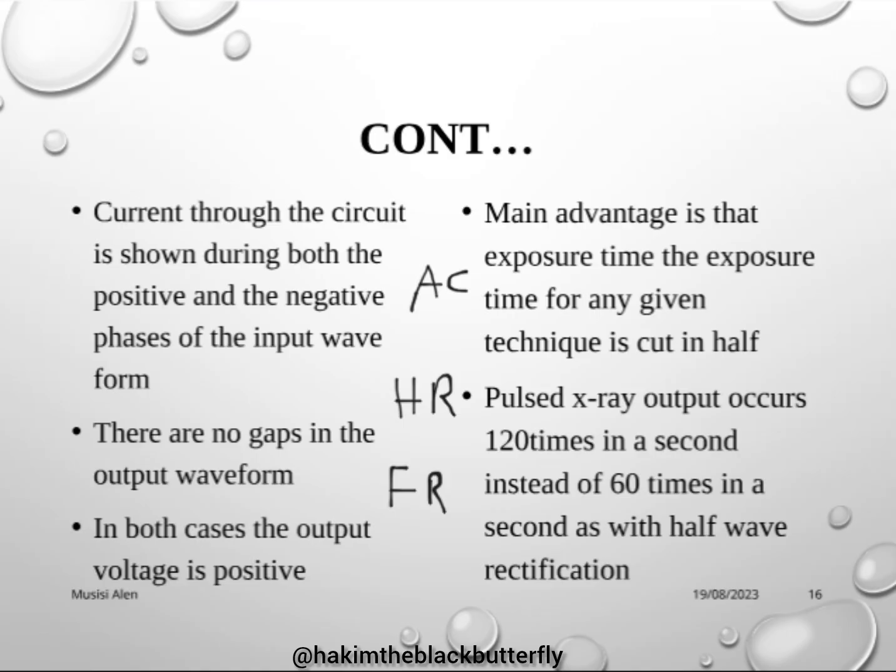But it also produces pulsed X-rays because you realize that the voltage falls from the maximum to zero and back to the maximum. Though now it will produce 120 pulses in a second. For the half-wave rectification, it was producing 60 pulses. This one is producing 120 pulses in a second.